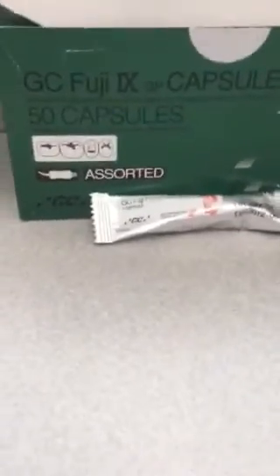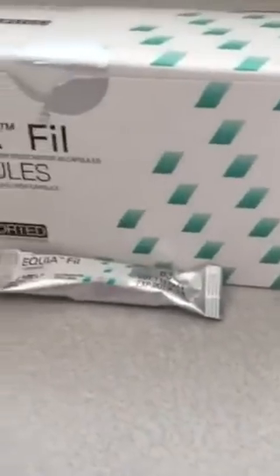This is the Equifil and the FUJI-9. They come in easy-to-use capsules. They're used for posterior restorative and they release fluoride into the tooth.